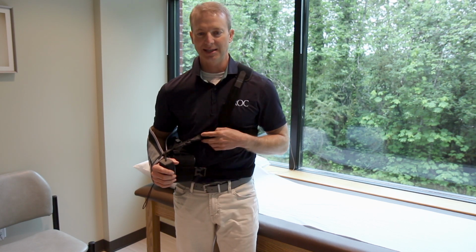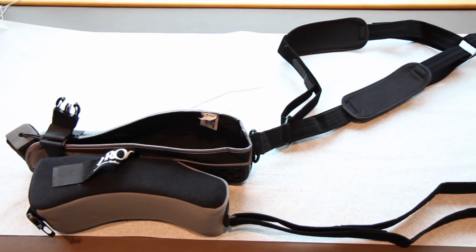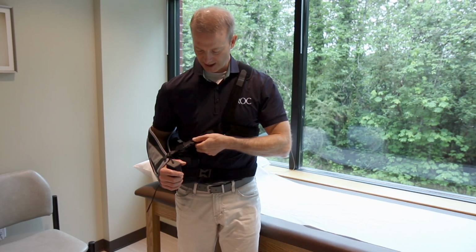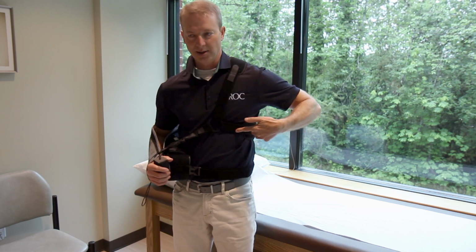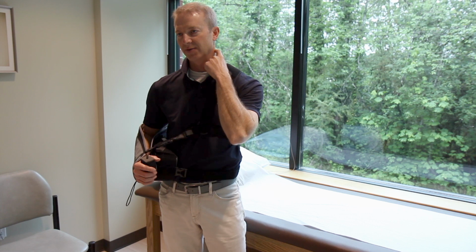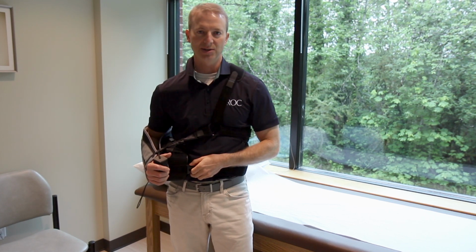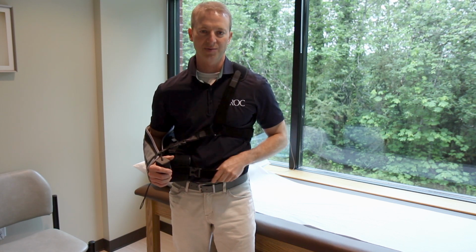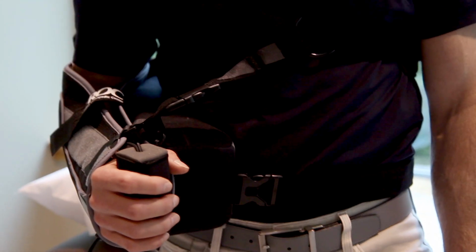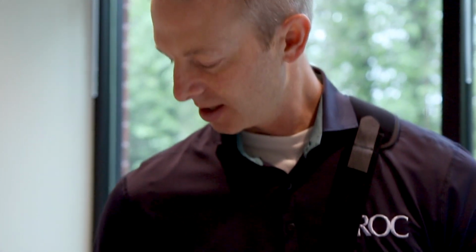And this particular sling that I've selected for my patients is a little more complicated, but it's designed such that it takes the stress of a strap off of your neck. By virtue of having the shoulder strap sling underneath your arm and over your arm, it takes the strap away from cutting across your neck. So it seems slightly more complicated, but once you get used to it, I think you'll find that's fairly comfortable and effective support.